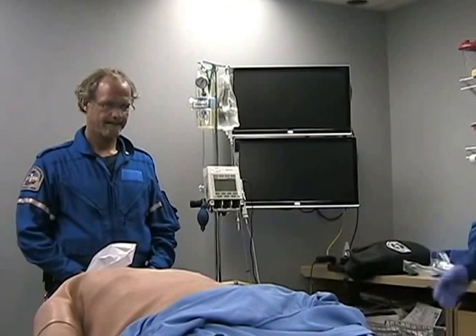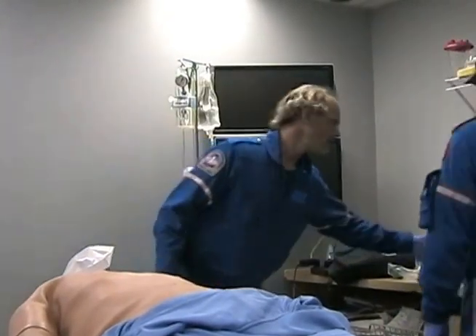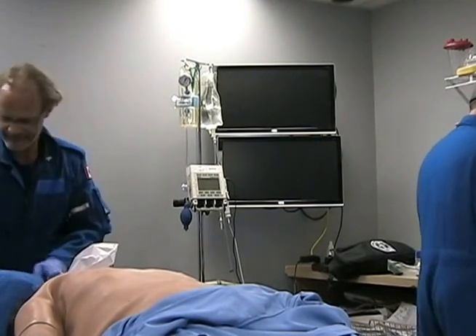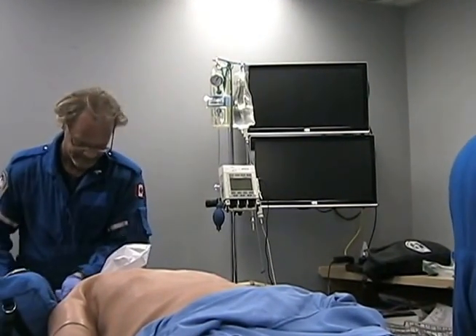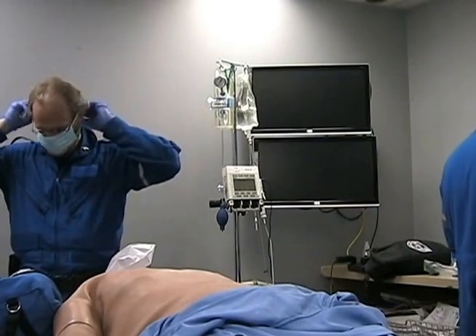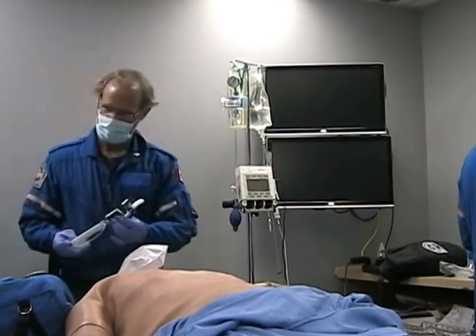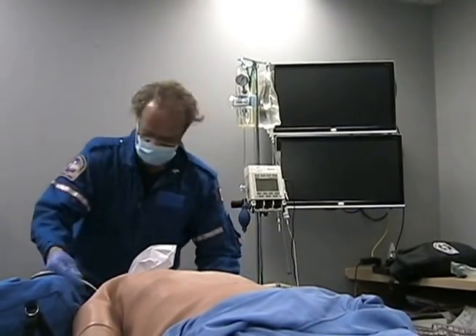Okay, so hey Scotty, it sounds like this guy does need to be intubated. I'll go ahead and get my stuff ready if you're good to get your stuff ready. Yeah, for sure. I'll get everything ready. Just going to drop some drugs. Yeah, you bet. Let's get the monitor on, get that end tidal warming up.